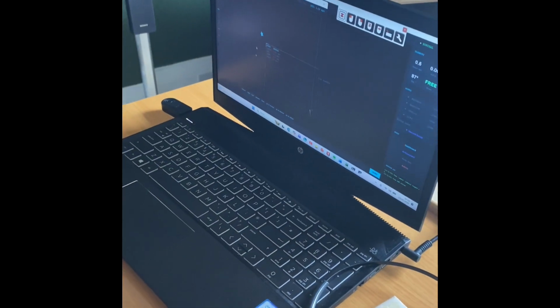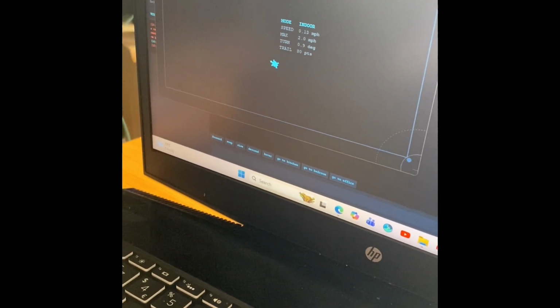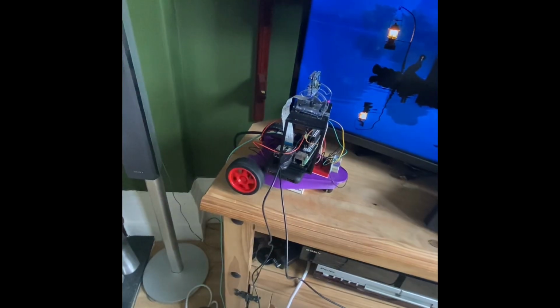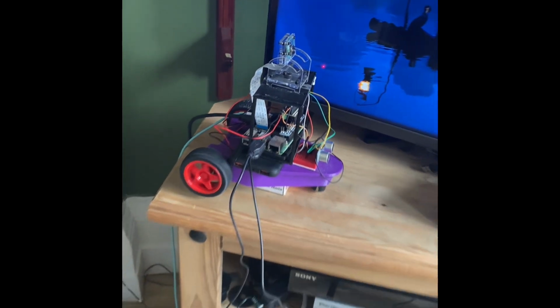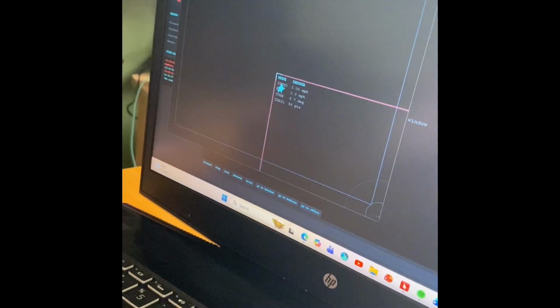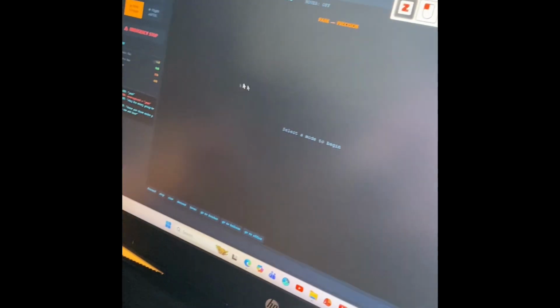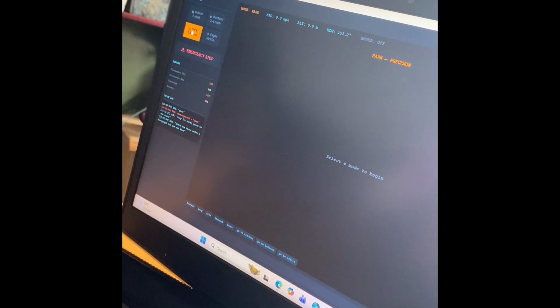This is the drive mode. I'm currently in the indoor simulation. If I move backwards, it moves the Python turtle, and this corresponds to actions on the Raspberry Pi. There are three modes for the graphical user interface, the two-dimensional version: indoor mode, outdoor mode, and park mode are all there.